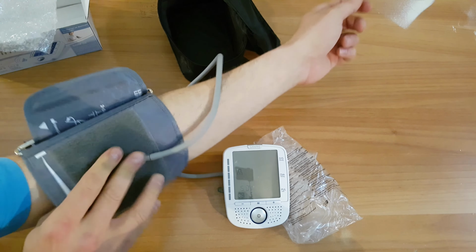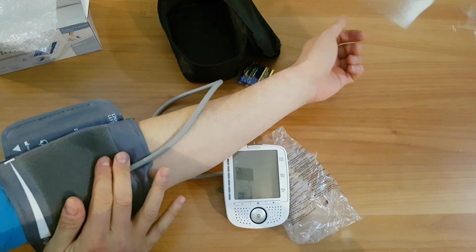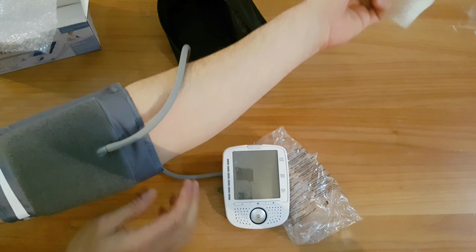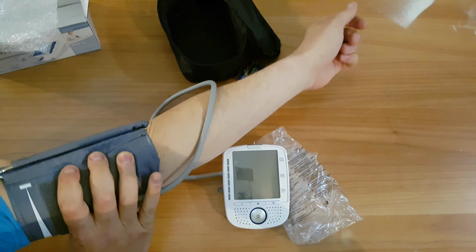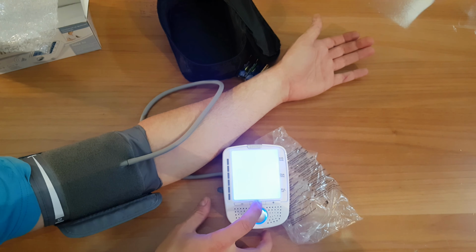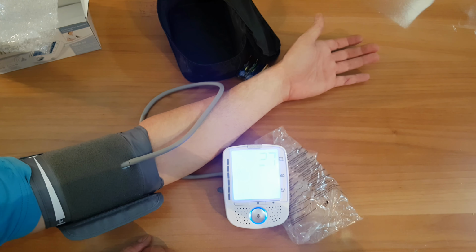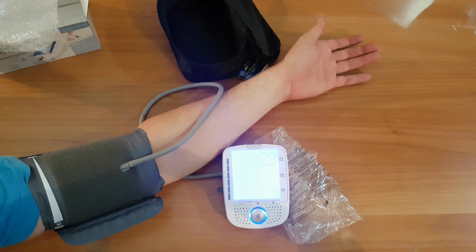Well, let's put that on my hand. You need that to be over your veins directly here, and tie it very well. Okay, nice. Start. You need to be very quiet and relaxed.